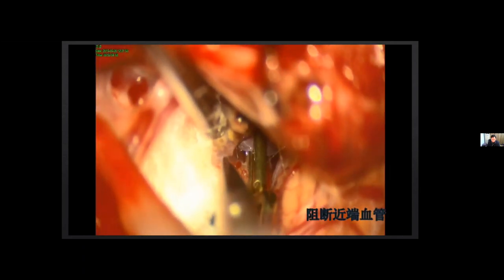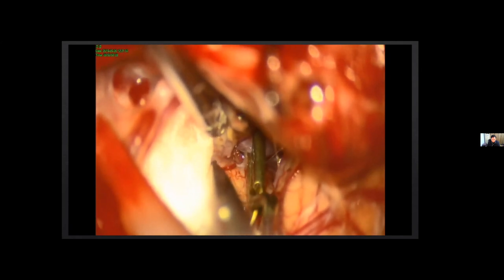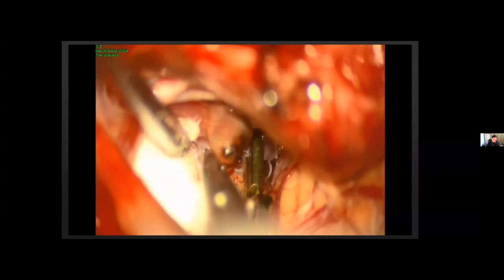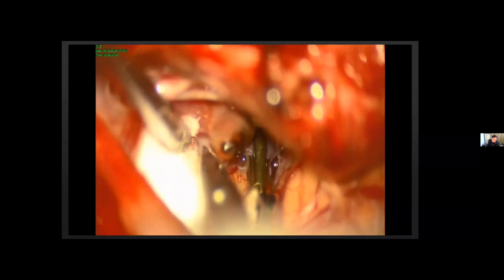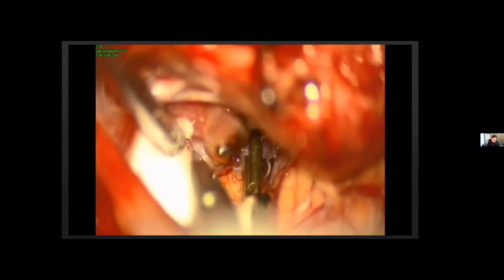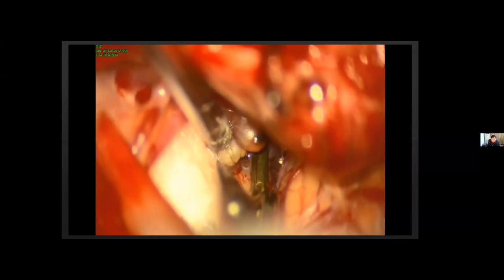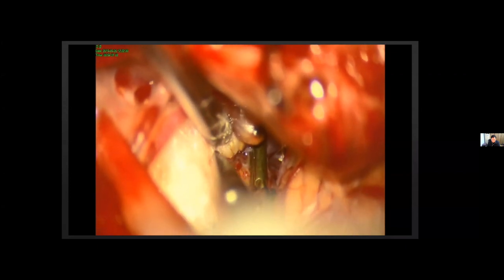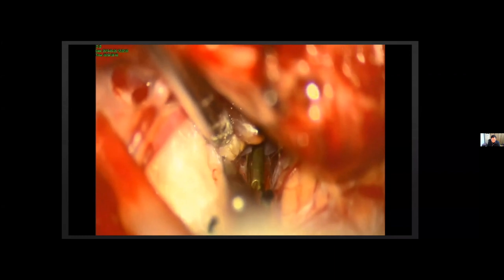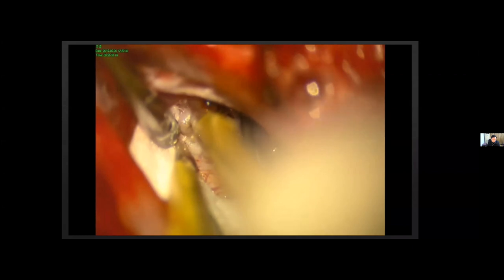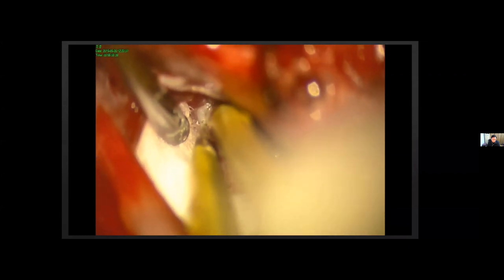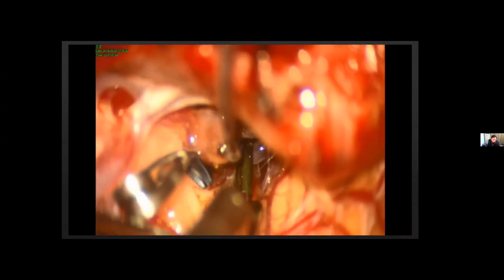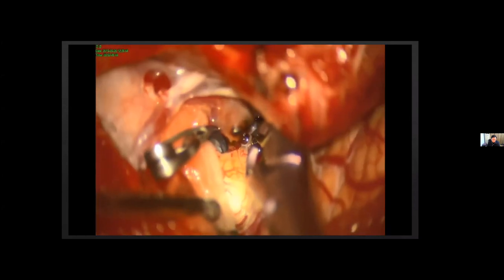You can see some nerve fibers attached to the dome of the aneurysm. A temporary clip is placed on the proximal part of the PICA, then we separate the dome, which is attached very tightly to the cerebellum.